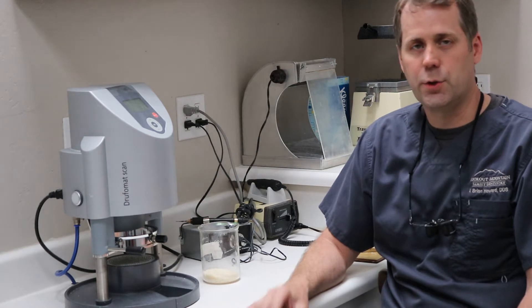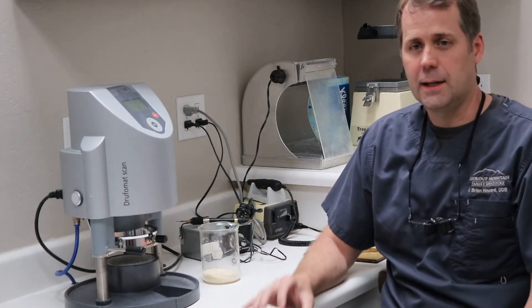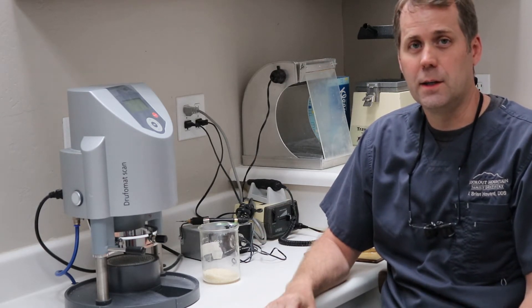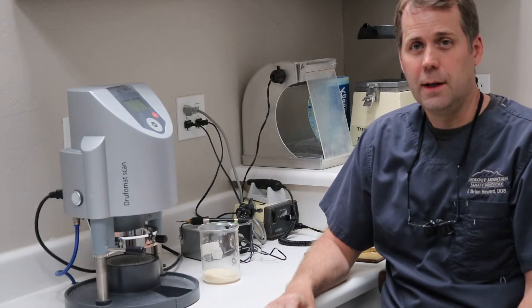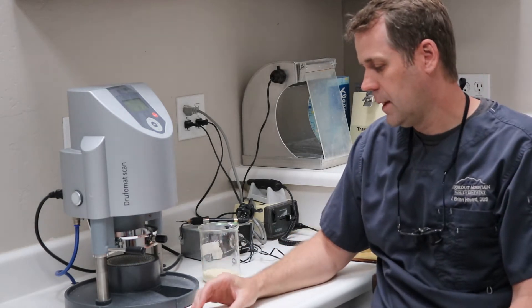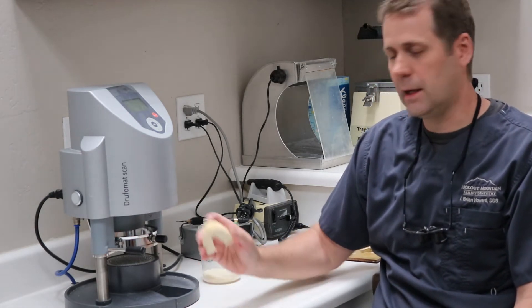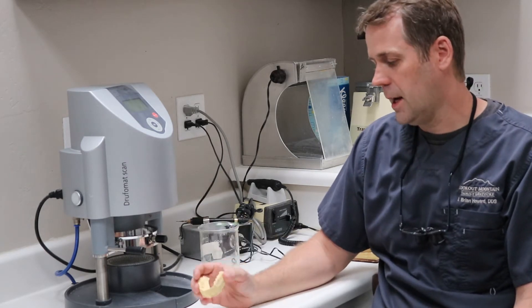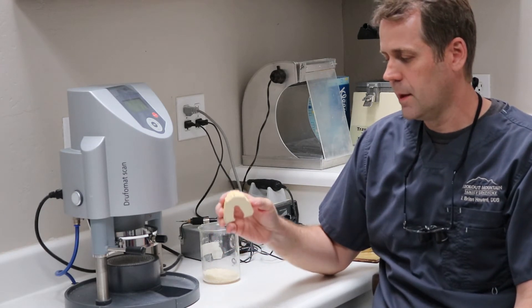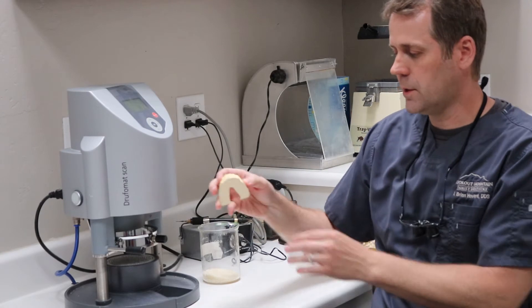One of the pointers I want to get to today is in trimming the cast. Taking the impression and getting a real nice cast is also one important thing in making a good custom fitted mouth guard. But one thing I've found in trimming the cast is it can be very helpful if you trim it at a certain angle, a certain direction. A lot of times we learn in school that we trim these casts parallel to the occlusal plane.